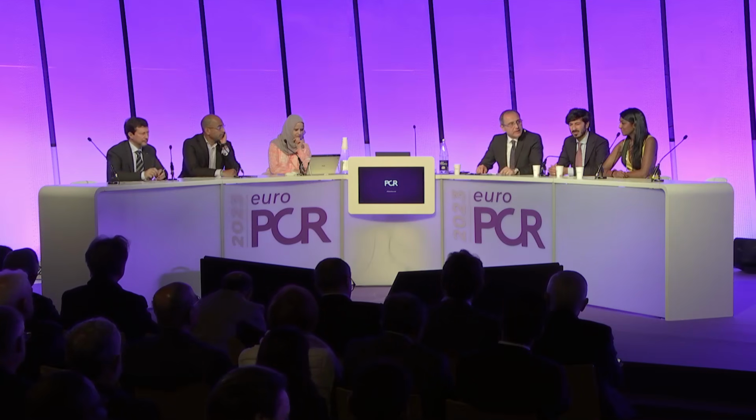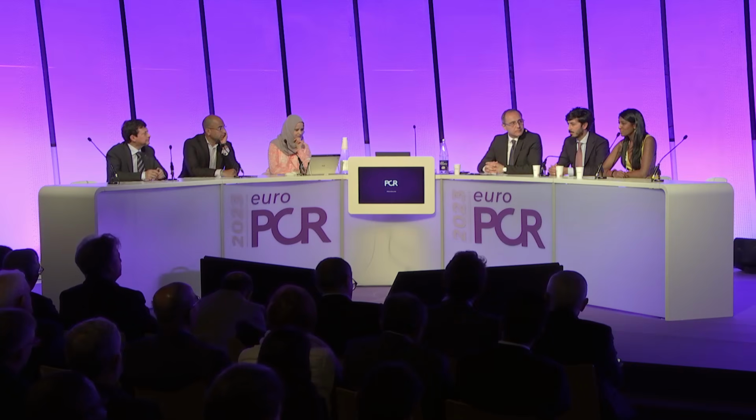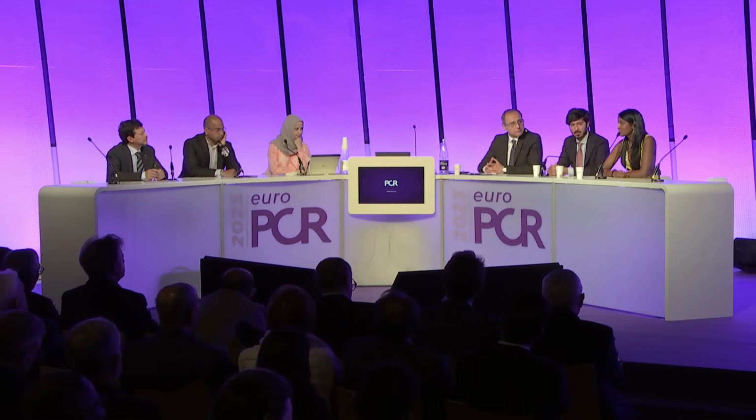Vani, about the burr size selection. Yeah, so I think this is where imaging actually is really helpful and pretty crucial, in that if you're going to size whatever adjunct you're using properly, then you need to know the diameter of the vessel accurately. So for rotablation, I've always been traditionally taught to go for about 50 to 60% of vessel size. So in this case, somewhere between 1.5 and 1.75 would have been fine.